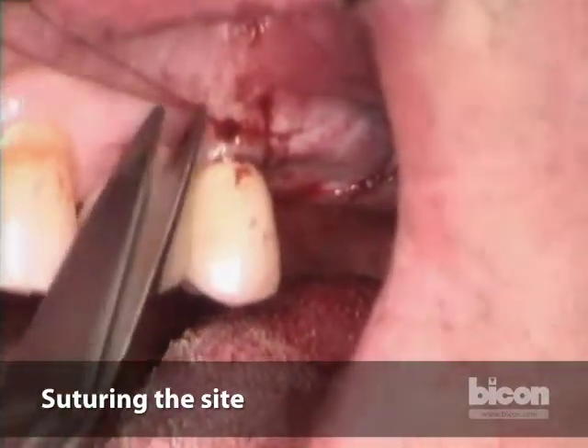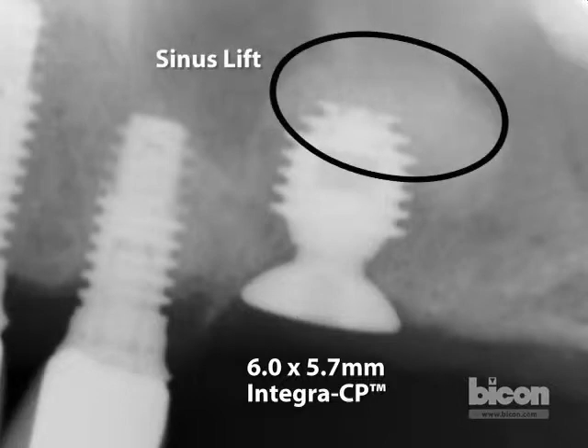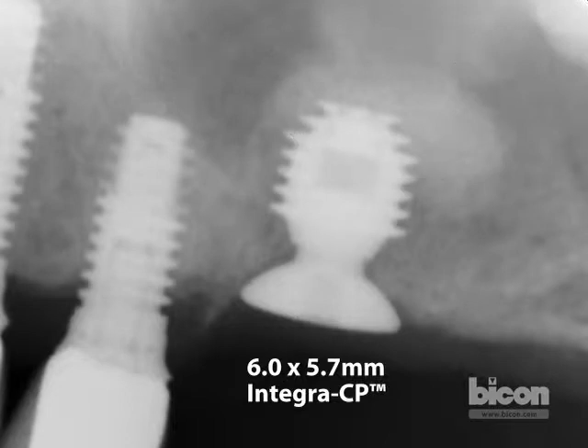It is very tempting when we have a little bit of bleeding to make the suture extremely tight, but that is really asking for trouble — it will cause necrosis of the flap or breakdown of the incision. The testament that we have done the floor transport correctly using the sinus lift abutment is that our flap is laying completely flat. On the radiograph, you can see the implant placed within the crest by no more than two millimeters. This implant is mainly in contact with the newly placed sinus lift graft, but as a testament to the plateau-designed implant, this one will integrate at the same time as the bone is turning over. Thank you and goodbye.